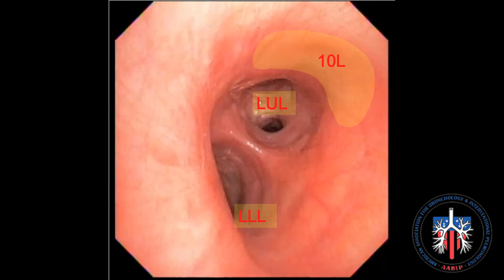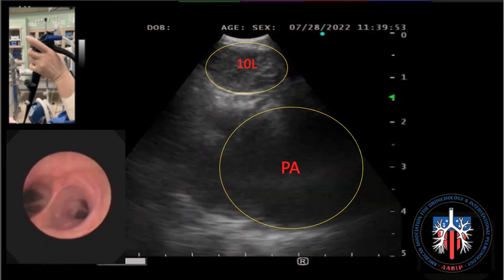The ultrasound transducer should be placed over the shaded area as shown here. On the ultrasound image, 10L is located below the upper rim of the left pulmonary artery.